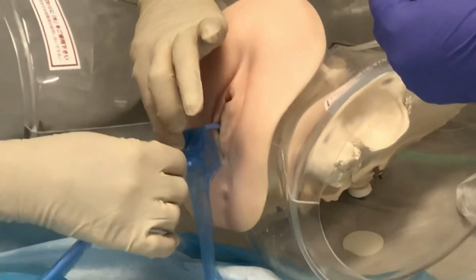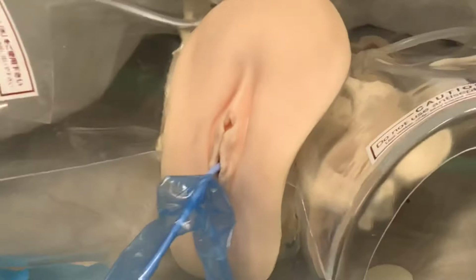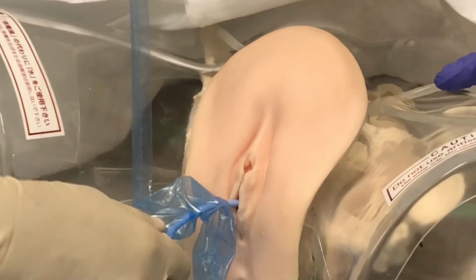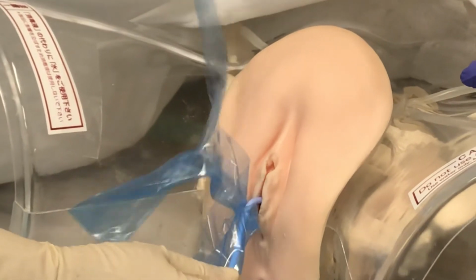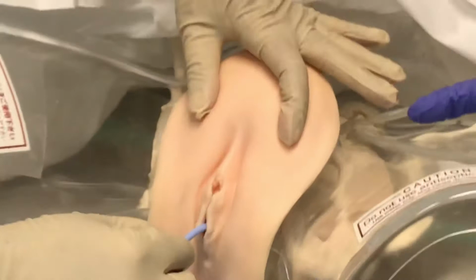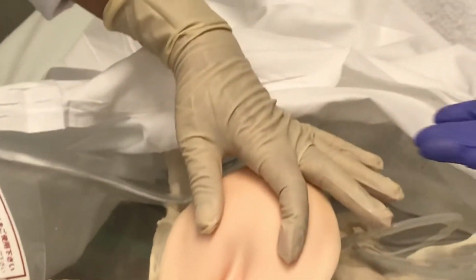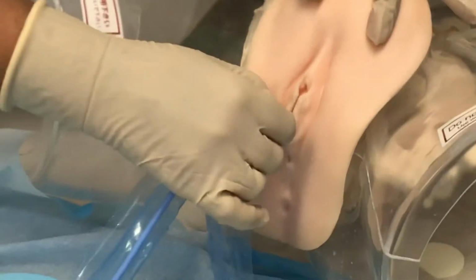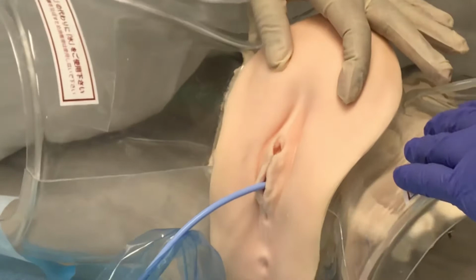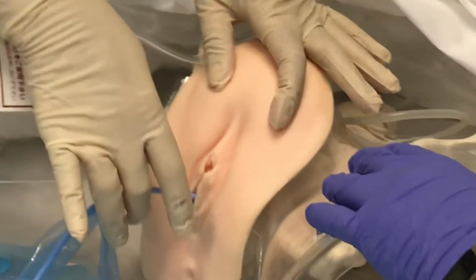You can see it also through here. Just call them and show them. They can see the bladder and how the catheter is entering. You see the blue one? It's not as easy as we think, because when I had cesarean surgery, they put this for me. The first thing I wanted them to remove when I became conscious was this. It is painful. So now it is in position, but the urine is not dribbling because of the position.